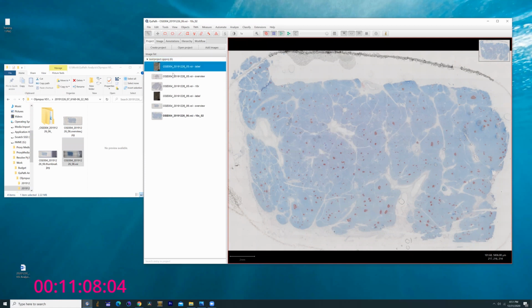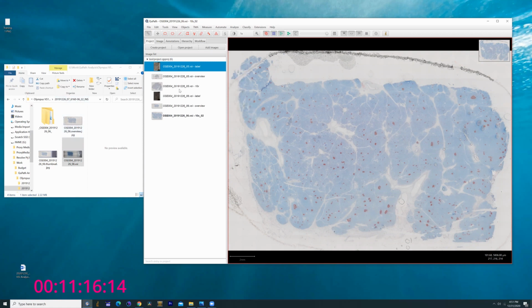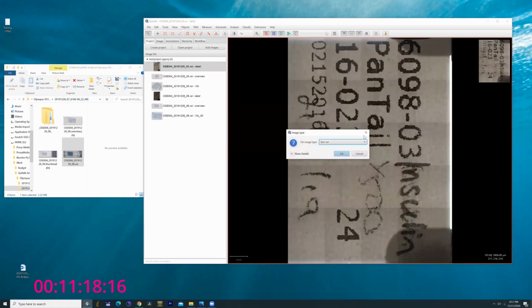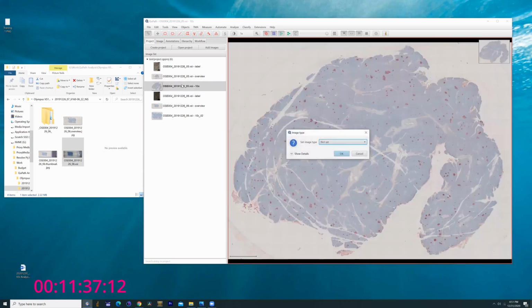I keep these files because, in case there's a mistake made in the loading of the machine or copying the database names into the file structure, there's an automatically built-in safety showing you exactly what was on the slide based on the way the slide was labeled. We can right-click these, rename the image, add metadata, edit descriptions, sort, and duplicate images, all sorts of fun things. For right now, let's focus on the first image here.